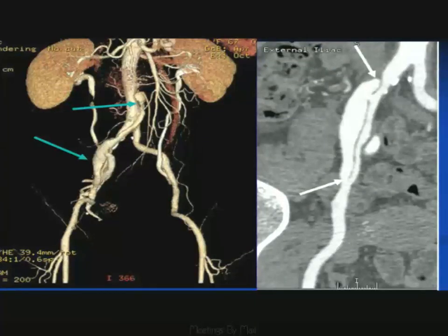And then just as a final example, here's a patient who's got a dissecting aneurysm of the common iliac artery on this right side, again, clearly portrayed by the curved plane reformation as well as the volume rendered display. And I think this dissection actually began in the subrenal aorta, where you can see the proximal aspect of the false lumen. We've had about 5 or 6 or 7 patients who've had spontaneous dissections without known cause of their aortoiliac system, who've had dissections but have not manifested ischemia, though these people are obviously likely or possible to get thrombi and thromboembolism.